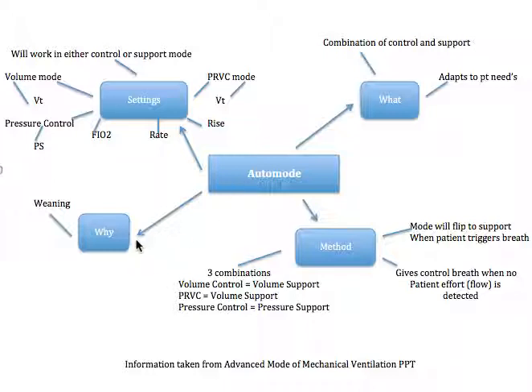So let's talk about why you would use this. You could use this for weaning, and I suppose you could probably even use it for patient dyssynchrony as well. But that is it for auto mode.